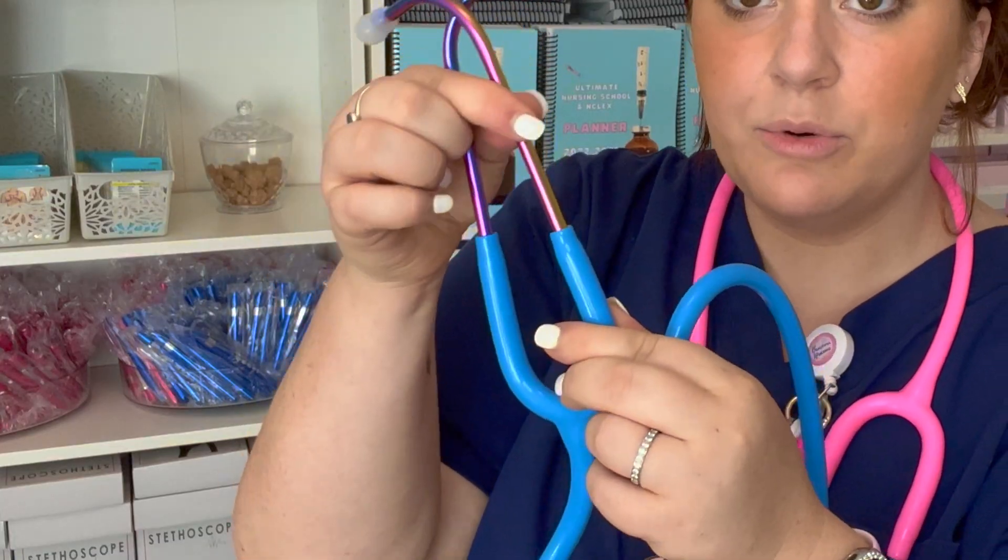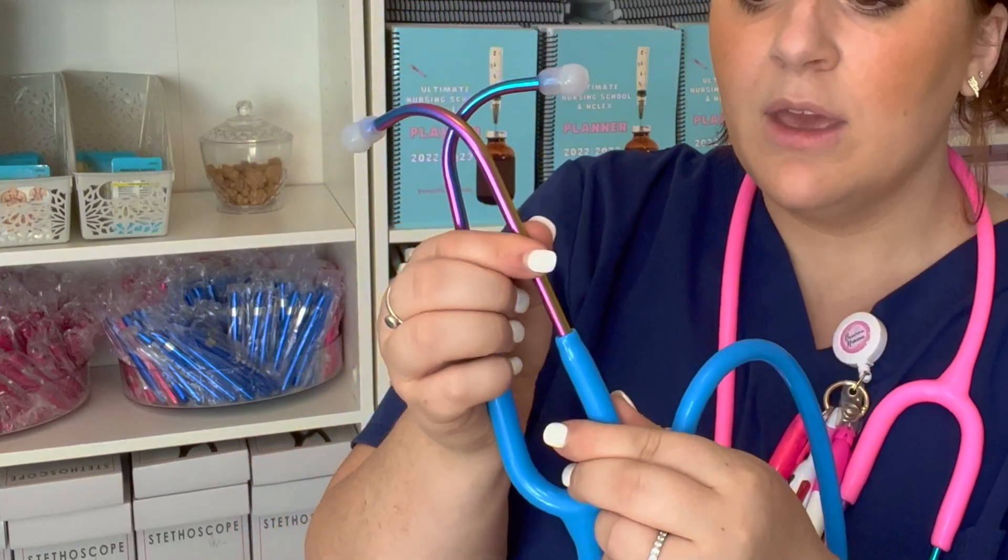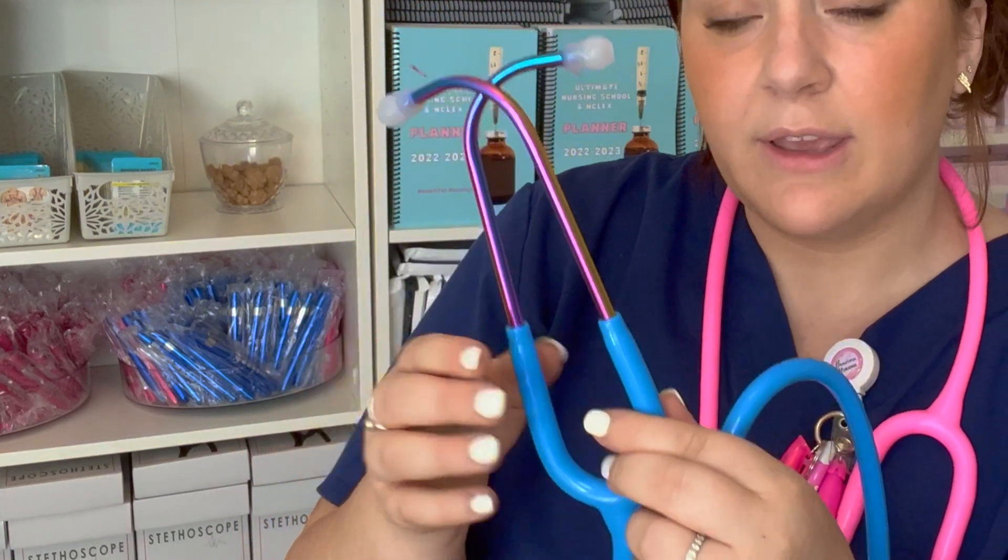The next part of your stethoscope is the tubing. You have this nice thick tubing with these stethoscopes because these are sound blockers — they're going to keep those external noises out. If for any reason you're having trouble hearing out of them and you have the diaphragm set, these are adjustable with the tubing. You can push these down or push these up in order to hear the sounds more clearly.